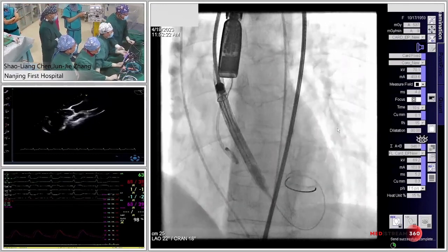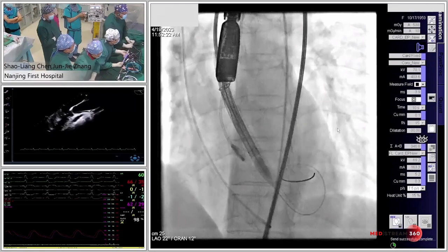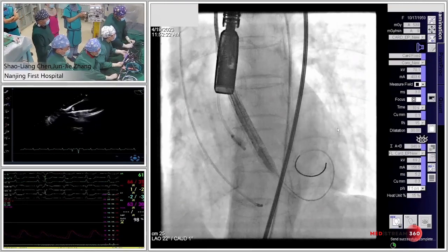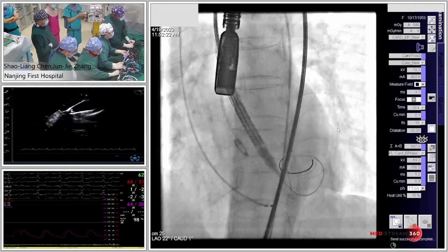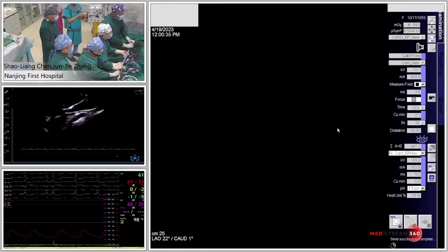So I think this step is very important. Junjie, can you explain how to define the position? Yeah, at this time, in terms of the bicuspid, sometimes it is very difficult to make the decision. With TE, we can see clearly. This view is very important. Separate the bicuspid. Let me take a picture at this time.